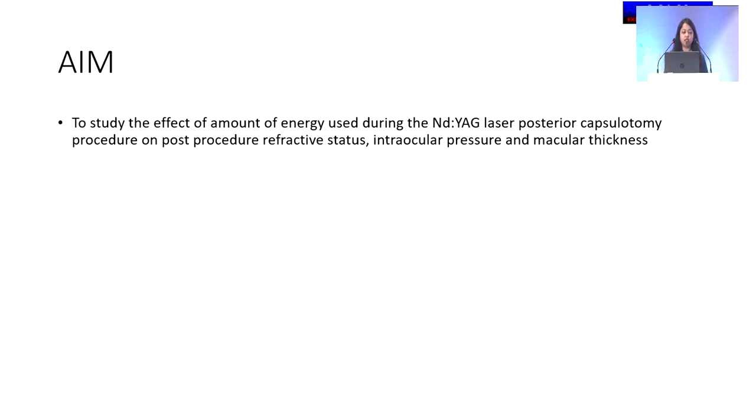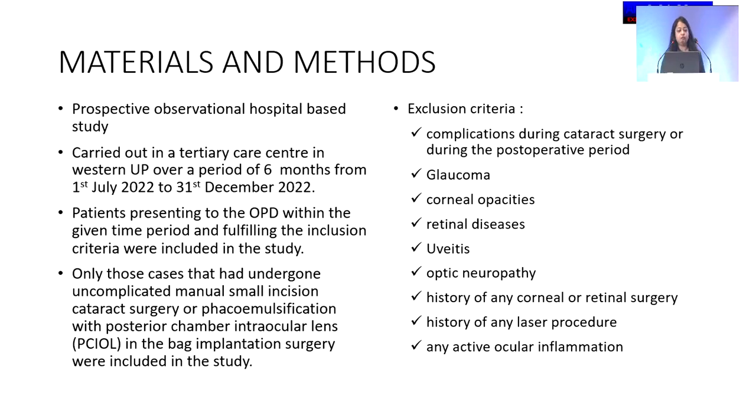The aim of the study was to study the effect of the amount of energy used during ND-YAG laser posterior capsulotomy on the refractive status, IOP, and macular thickness. This was a prospective observational hospital-based study carried out over a period of 6 months in a tertiary care center. Patients presenting to the OPD within the given time period and fulfilling the inclusion criteria were included.